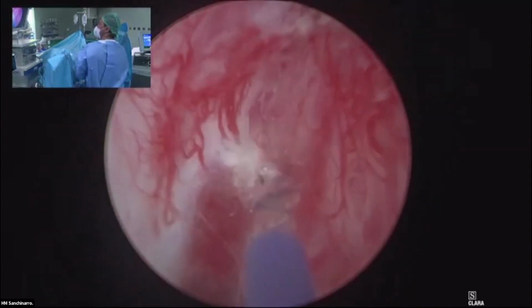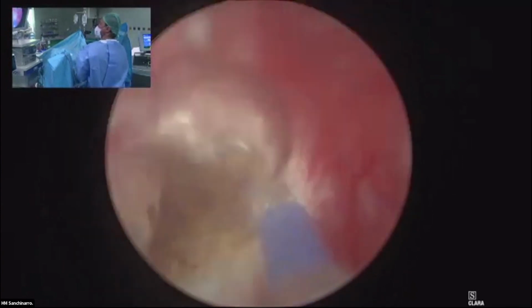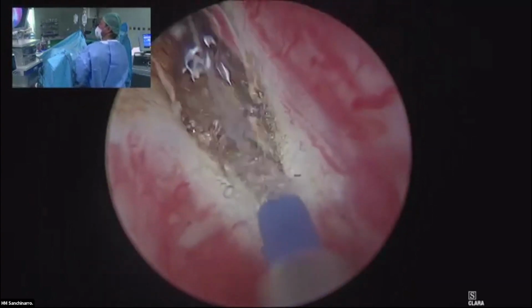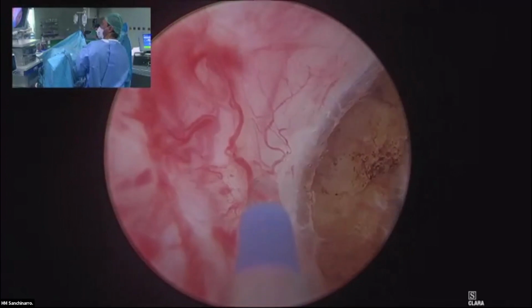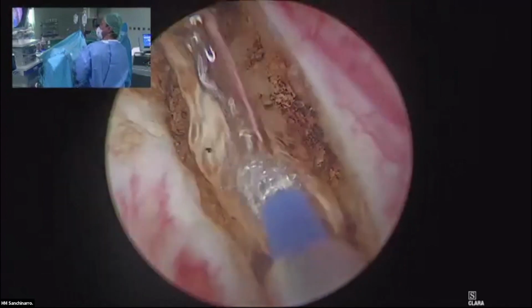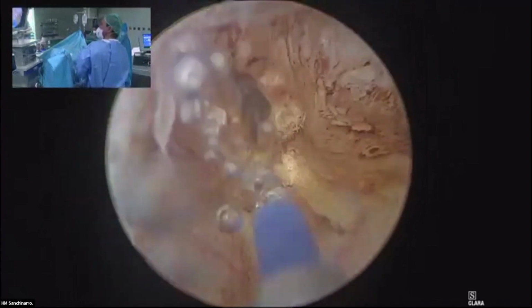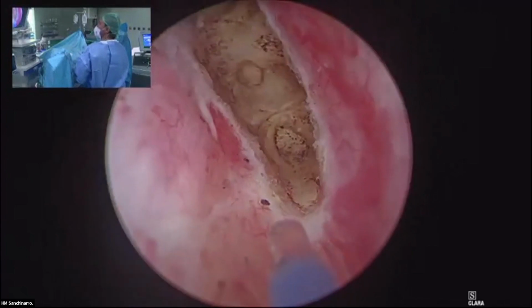So this is a kind of classic thulium. Not the new ones. You see that I'm just surrounding the verum montanum with a horseshoe incision. You see? Unlike the other live surgery you've seen, due to the continuous emission, you have more carbonated tissue, but this won't be a big problem. Okay?